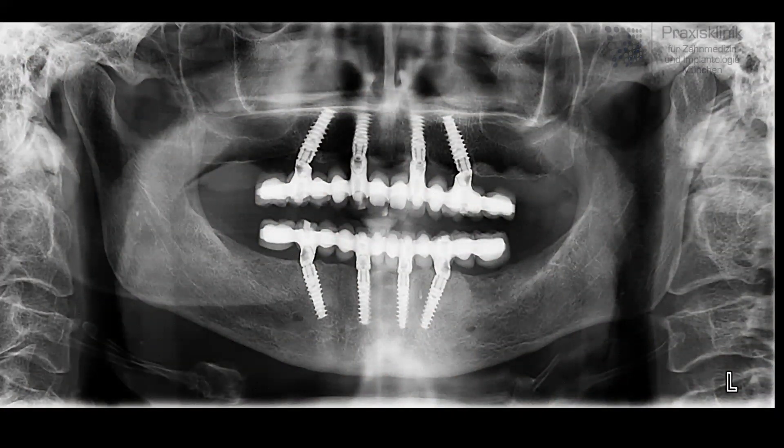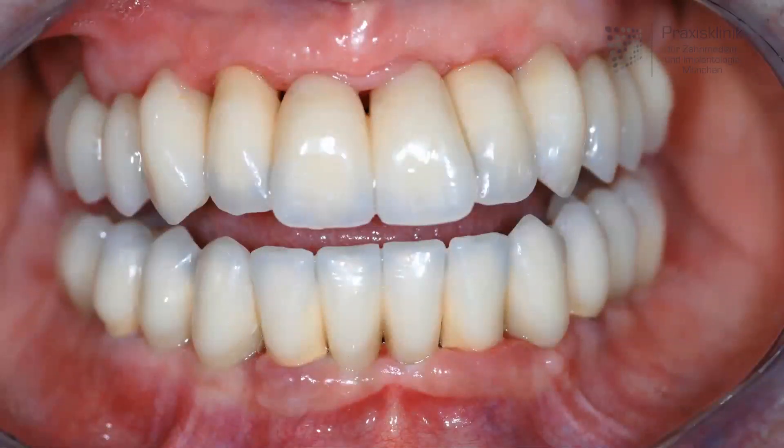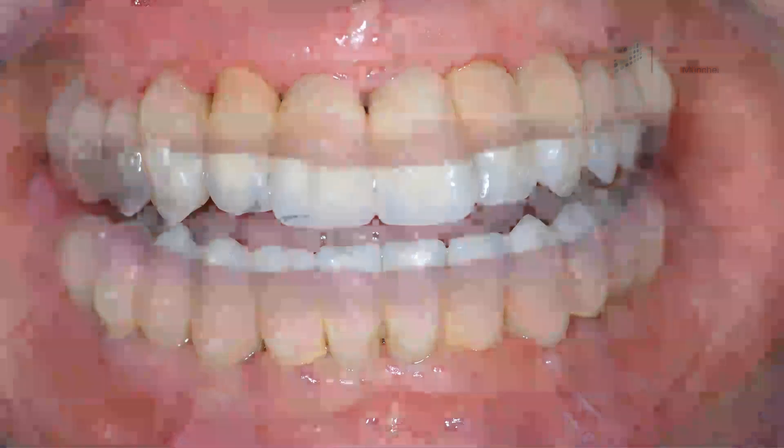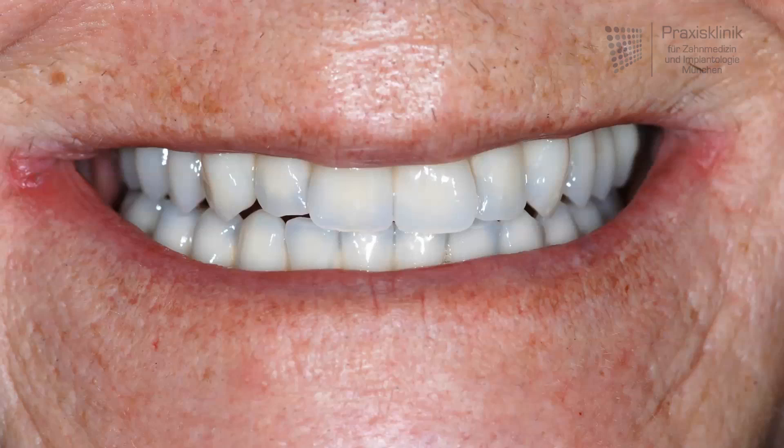The X-ray image immediately after the insertion shows that we have two full arch bridges in the upper and the lower jaw, supported by four implants each. This kind of implant supported restoration is a very comfortable solution for the edentulous patient. And the last picture shows the very aesthetic treatment result.